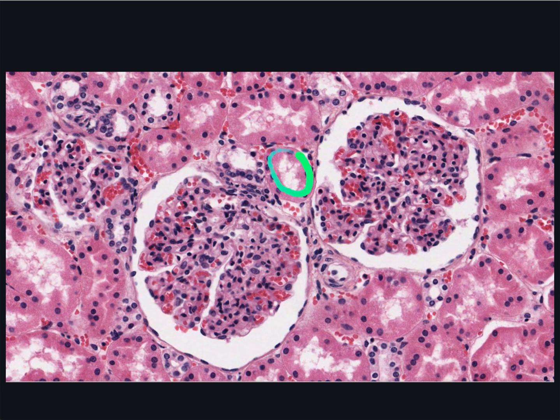On the other hand, the distal convoluted tubules are shorter, and so less profiles are seen right next to the glomeruli. They lack a brush border, so their apical area is a lot cleaner. And they're less eosinophilic, so they appear pale. Here's a profile of one here, and another one here. But I'll point them out again in another image where their profiles are much more numerous.